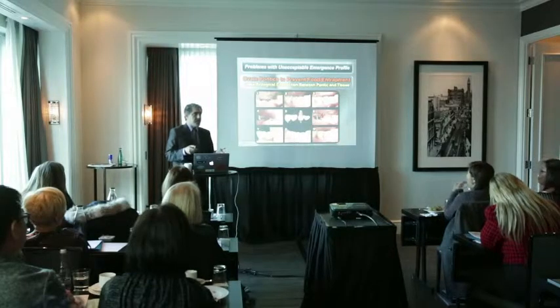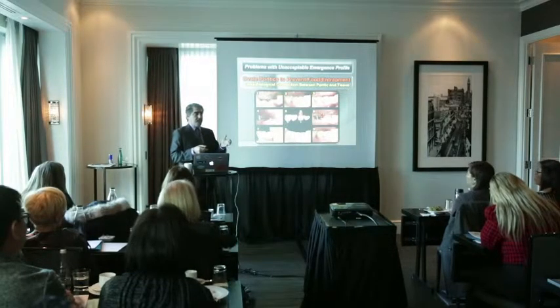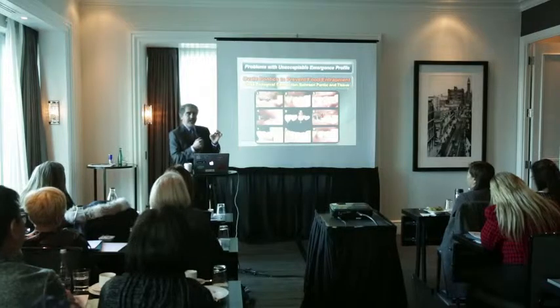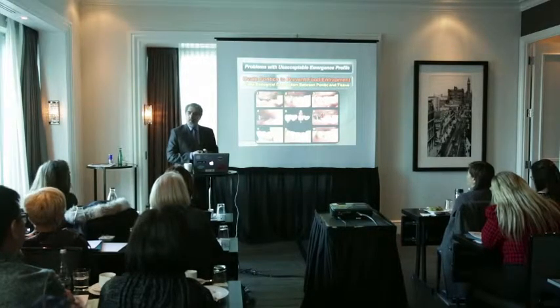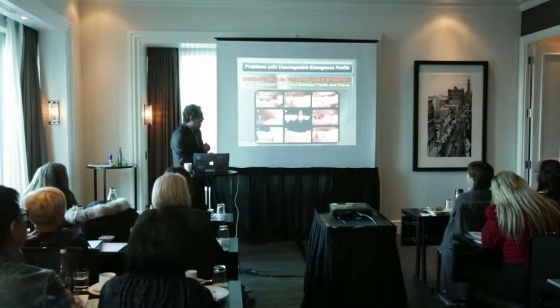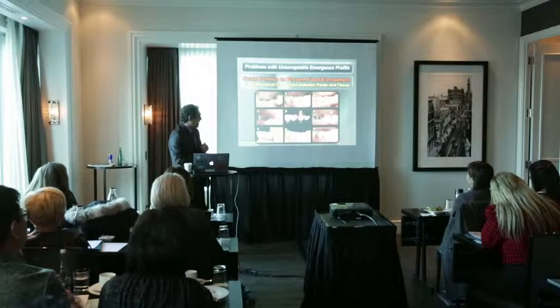Sometimes I use the electrosurgery. I'm pretty sure that you have used that too. You use this electrosurgery to make a crater area, an area of depression. And then you make your temporary, you add composite to the pontic, you make the ovate pontic in the area, and then after a while you're going to have a nice pontic area, as you can see here. It was not like this here. Now you have a pontic area here.